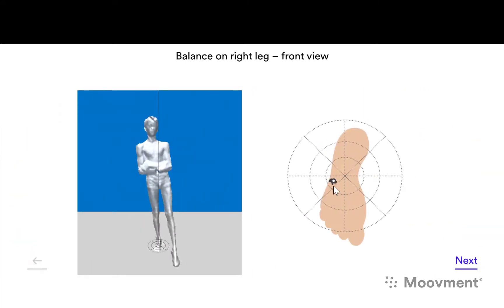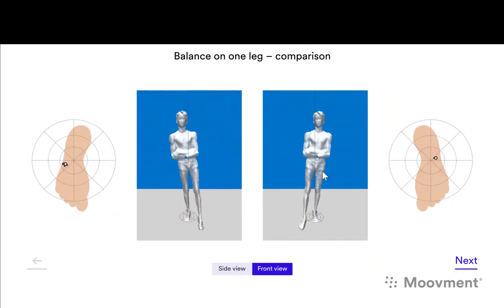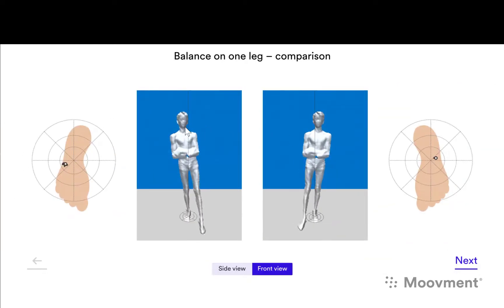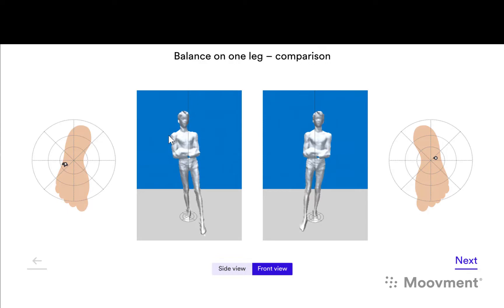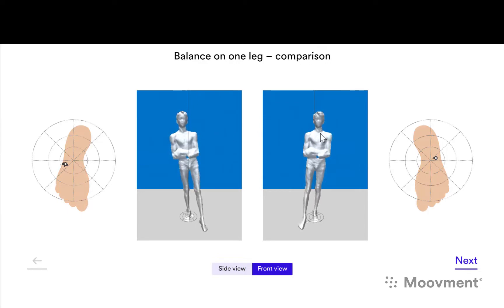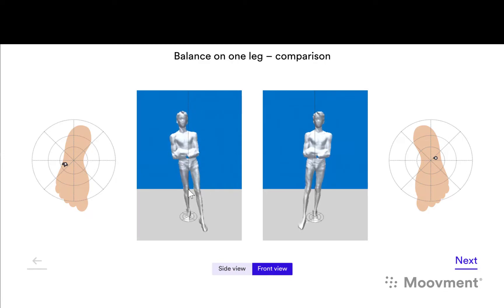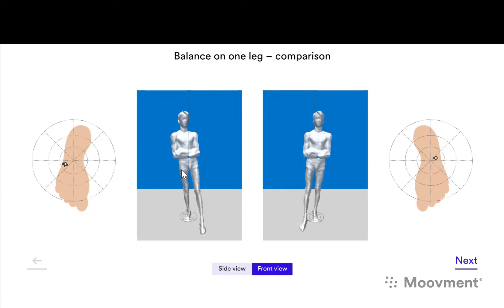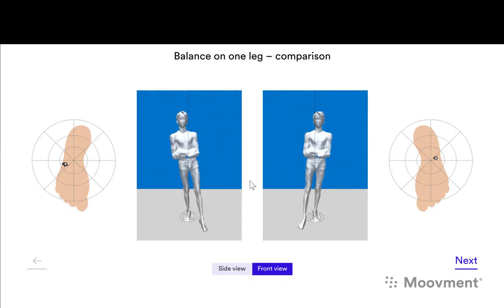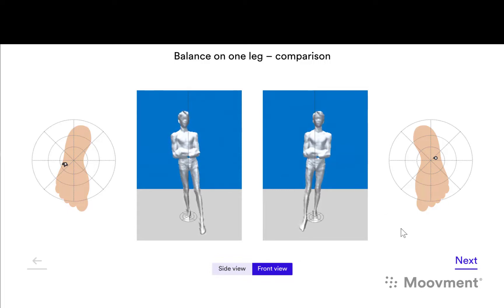You can see his balance on the left is a little bit lateral to the axis of the foot. Balance on the right is far more lateral, and if you need to compare those two, you can see the position of the head and the shoulders to the right is much more extreme compared to on the left, and that's not a surprise when his right hip is internally rotated—he'll be far less stable in that case compared to the left hip which seems to be in a more neutral position.